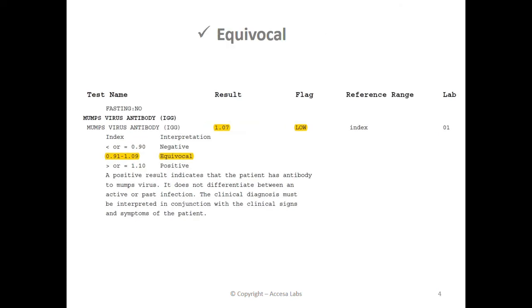Now let's take a look at an equivocal result. This result shows 1.07 and a low flag, and based on Quest Diagnostics Result Index here, any result between 0.91 and 1.09 is equivocal, which means that the result is neither negative nor positive.